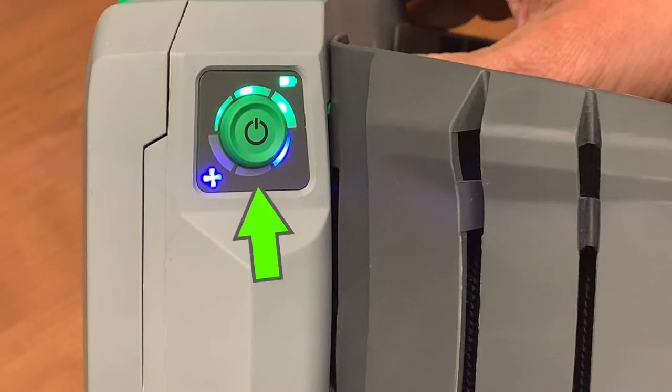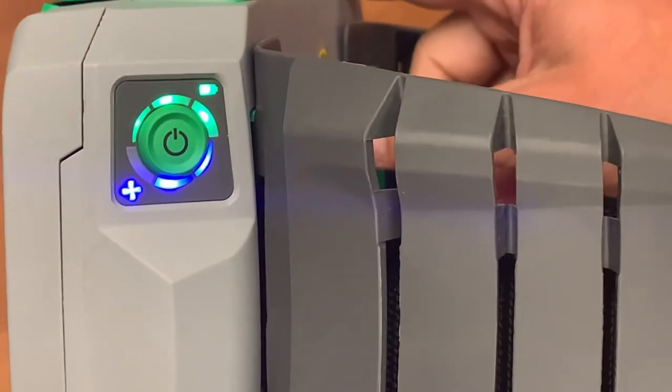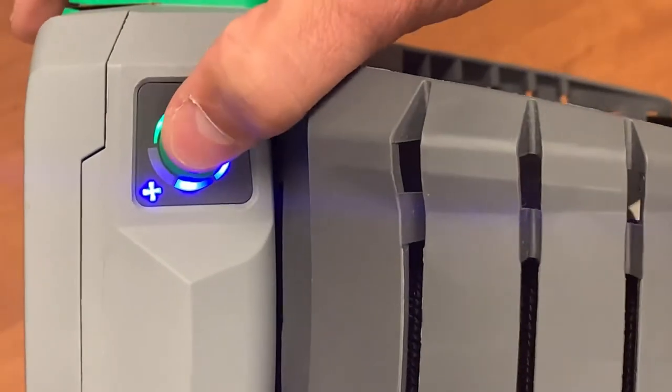The three lights on the bottom of the power button are the airflow indicator lights. One light is level 1, the lowest airflow setting; two lights for level 2; and three lights for the highest airflow setting at level 3.